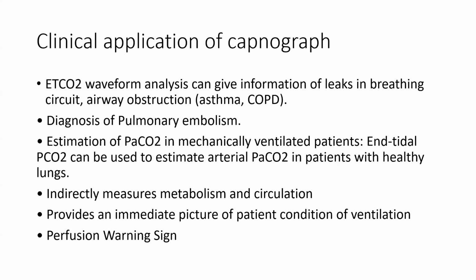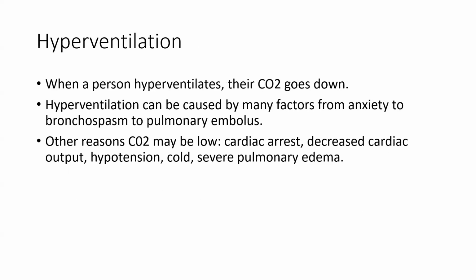Now, the clinical applications of the capnograph. CO2 waveform analysis can give information on leaks in the breathing circuit and airway obstruction. Diagnosis of pulmonary embolism. Estimation of PaCO2 in mechanically ventilated patients, and end-tidal CO2 can be used to estimate arterial PaCO2 in patients with healthy lungs. Indirect measure of metabolism and circulation. It provides an immediate picture of the patient's condition of ventilation and perfusion.